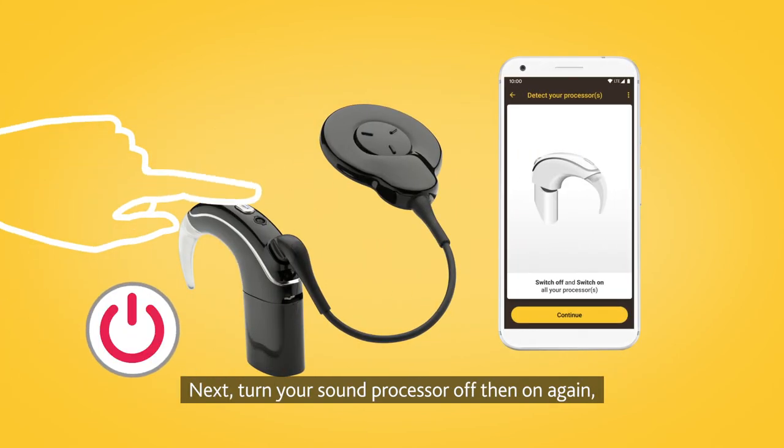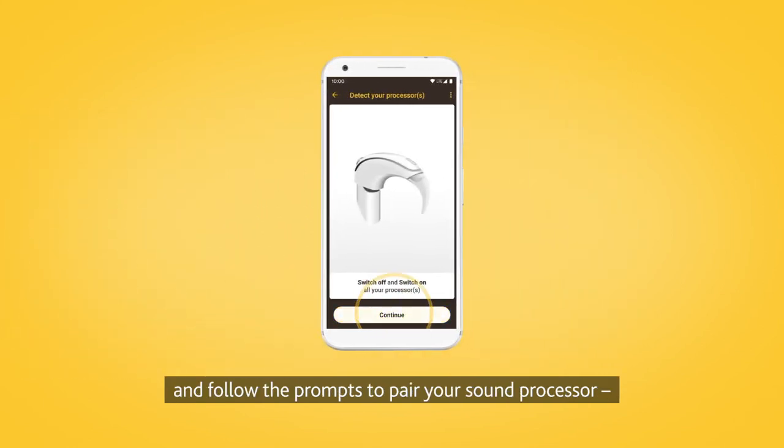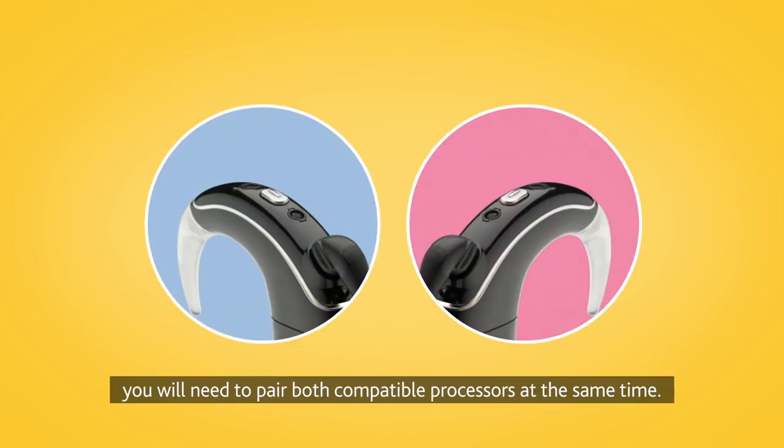Turn your sound processor off, then on again, and follow the prompts to pair your sound processor. If you have two processors, you will need to pair both compatible processors at the same time.